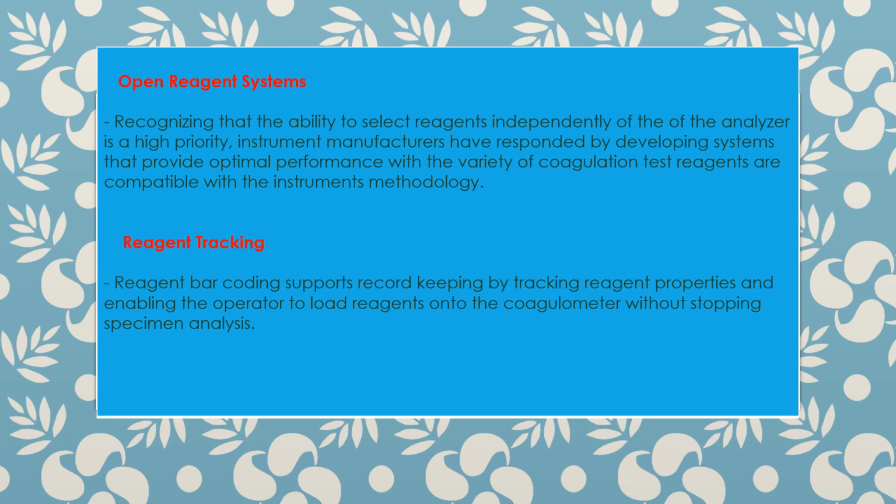Open reagent system. Recognizing that the ability to select reagents independently of the analyzer is a high priority, instrument manufacturers have responded by developing systems that provide optimal performance with a variety of coagulation test reagents compatible with the instrument's methodology.